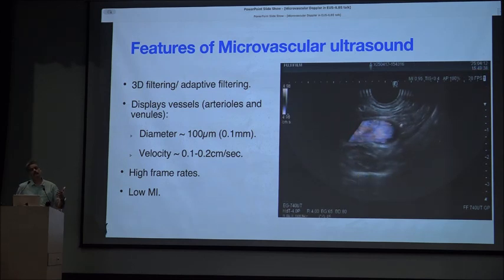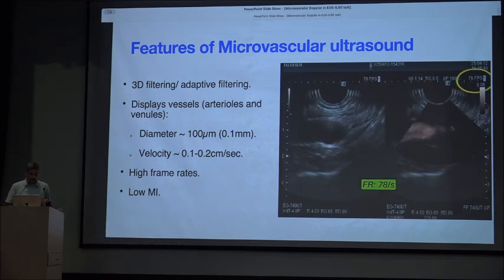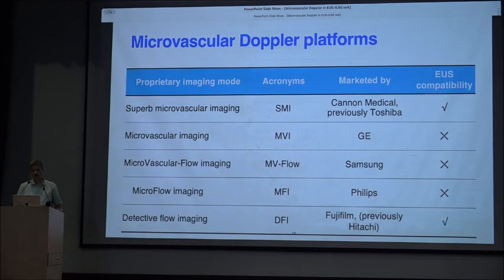This is because of something called plane wave imaging, or thick beam or fat beam imaging. Again, I don't have time to go into what it means, but the temporal resolution of such a high resolution spatial imaging is also excellent. Now, these are the microvascular Doppler platforms.